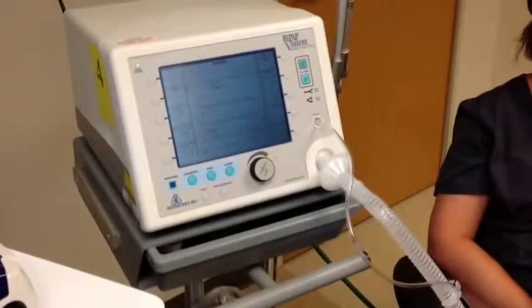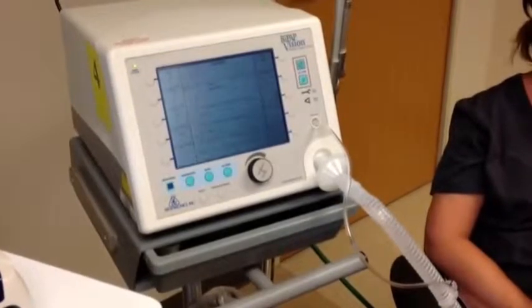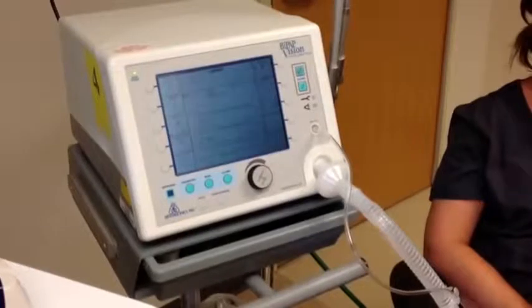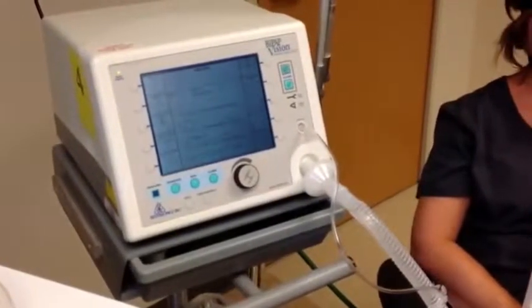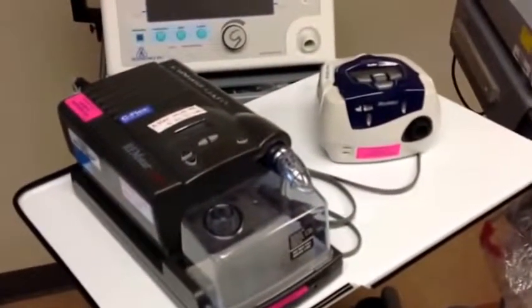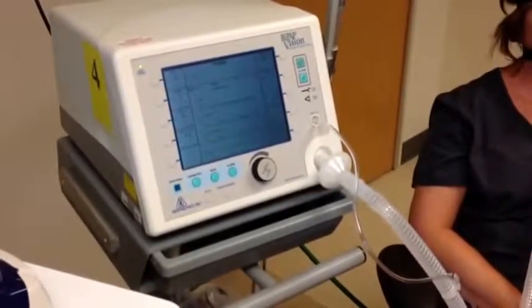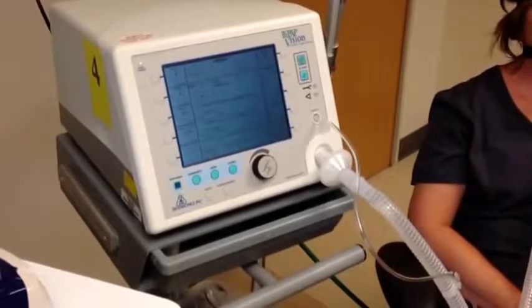This is an introduction to BiPAP video intended for nurses caring for patients on comfort care, presented by the Methodist Hospital Respiratory Care Department. BiPAP consists of a continuous pressure like a CPAP called EPAP on a Vision, but has a larger pressure that kicks in during inhalation to actively assist with breathing, referred to as IPAP on a Vision.